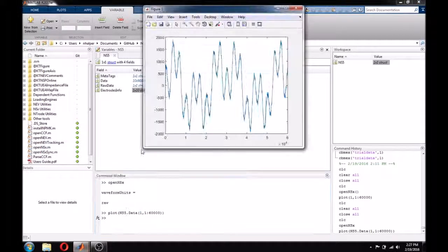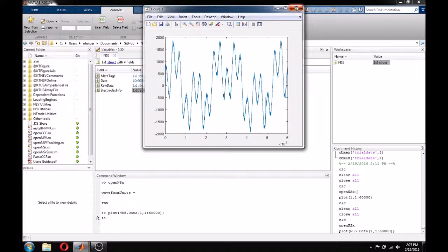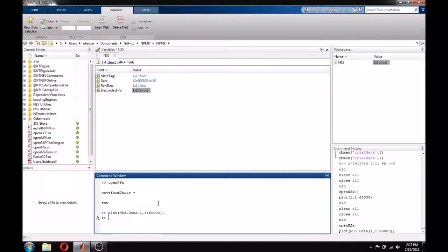OpenNSX has a number of parameters that can be passed, such as specifying file name so that it can be used in a script, downsampling the data, or opening only specific ranges of time or channels. All of these features are covered in the help documentation, and can be accessed by typing help OpenNSX, or simply by opening the function.